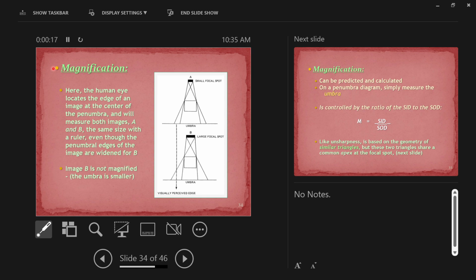Magnification is a misrepresentation of the size of an object. So here we're not talking about changing the shape of something. You notice that hand that I showed you was unsharp, right? But ignoring the fact that it was unsharp compared to the first one, that hand was larger on screen than the first one. It was a physically larger looking hand. That was the same hand though. I used the same hand for both images, right? So what changed here?